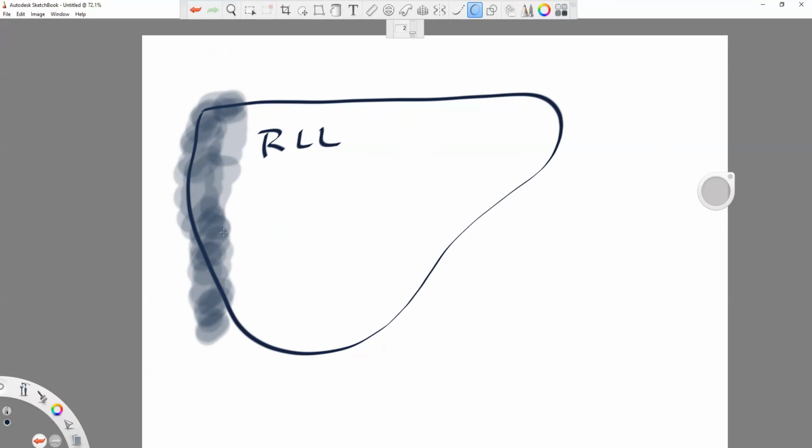This is a non-visible region of the liver when we're looking through the costal image, a kind of coronal image through the right side of the patient. If you can't see this, you cannot measure from here to here because you can't see it. Sometimes you can go just a little bit into a shadow if you know for sure, like on the very tip of a kidney. Sometimes it's just barely shadowed out, but you know where it ends. That's okay.